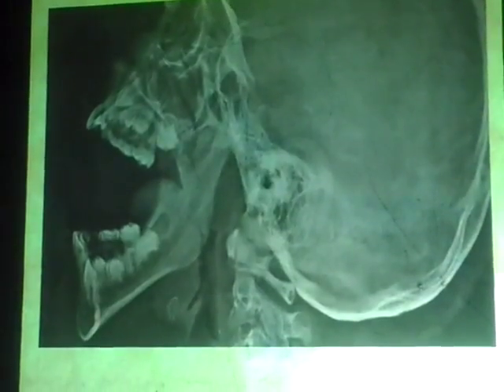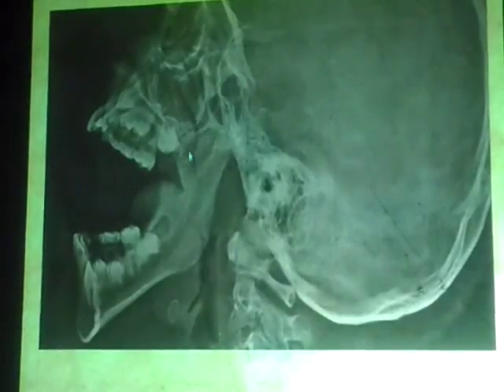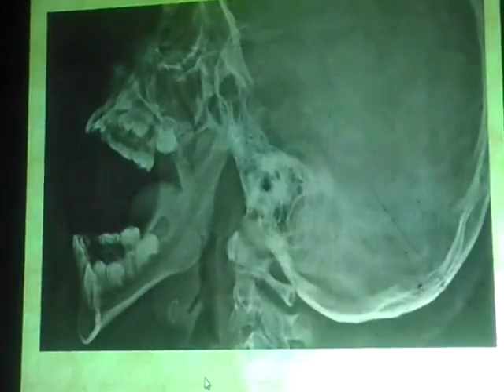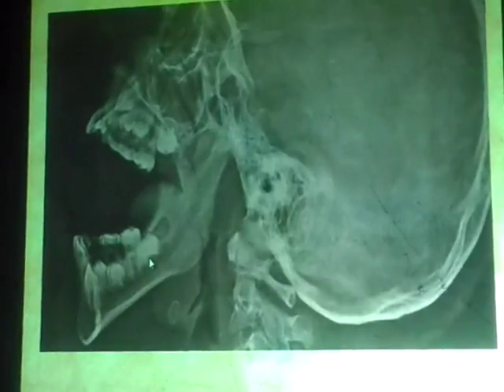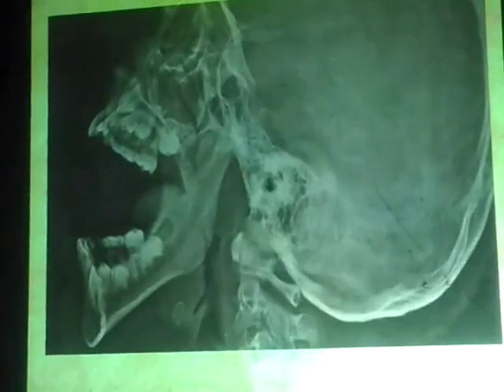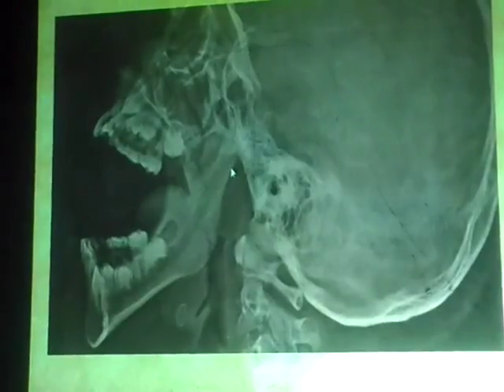And I will give you an example. This is the plain X-ray view, the lateral soft tissue view to detect the adenoid. And here is the soft tissue of the adenoid. It's a large one. There are some precautions we have to know while we are doing this type of X-ray. The child should have his mouth open, and this is because we don't want the child to swallow. If your mouth is open, you cannot swallow. Because if your mouth is closed and you swallow, the soft palate is going to move upwards and hinder the view of the adenoid.